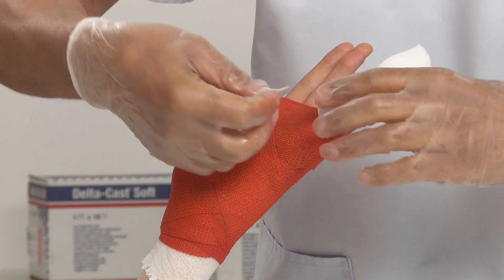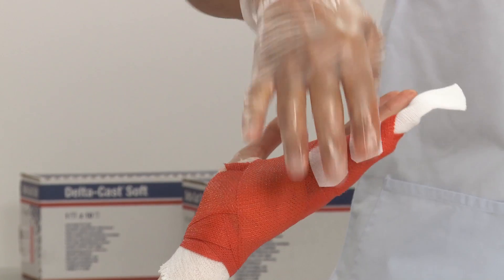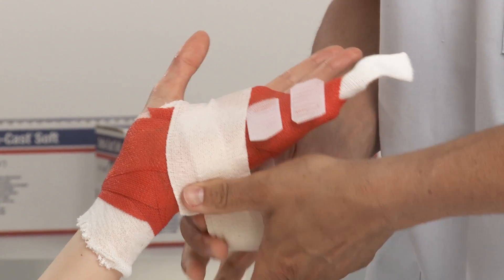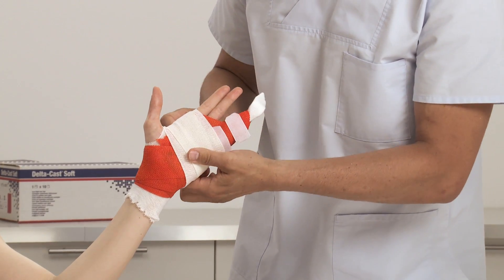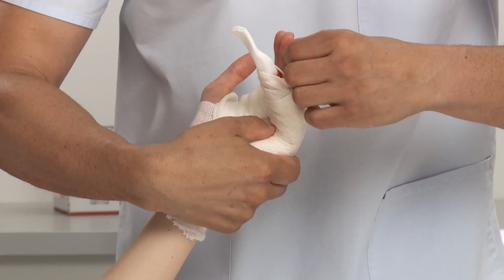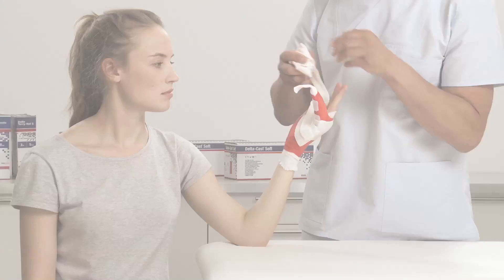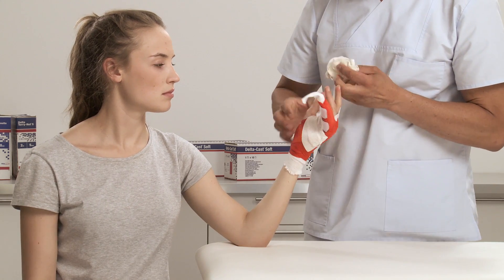Cut pieces of adhesive hook strap and place them onto the cast tape. For good lamination of the adhesive hook to the cast tape, wrap an elastic bandage around the cast using slight tension. Mould the cast with the palm of your hands and check the desired range of motion and any points that may cause irritation or pressure. Keep the bandage in the limb position for around 5 minutes until the cast and reinforcement strip is set, then remove the bandage.